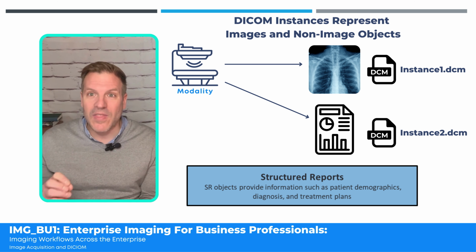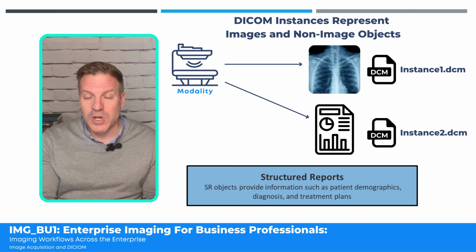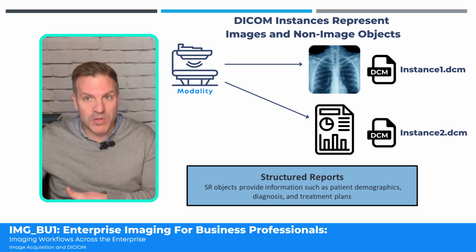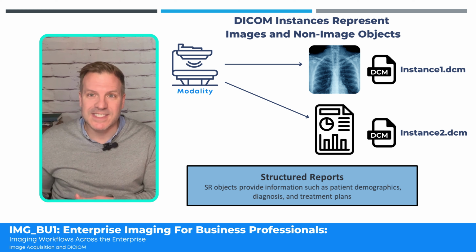But when we look at the opportunity of capturing that, there are these items called DICOM structured reports that allow us to receive the information about the dose that was emitted, but this is not an image file. This is not an image instance. This is a structured report.